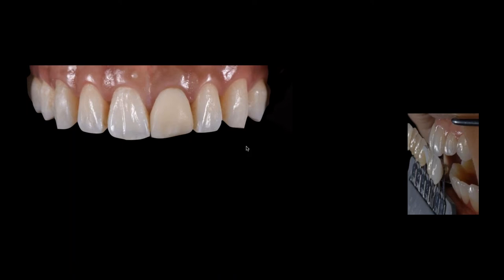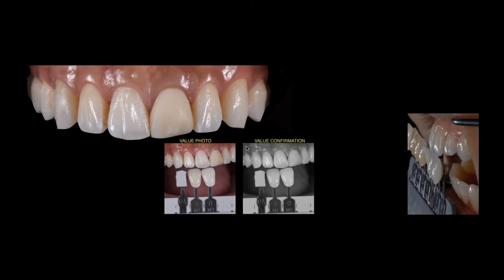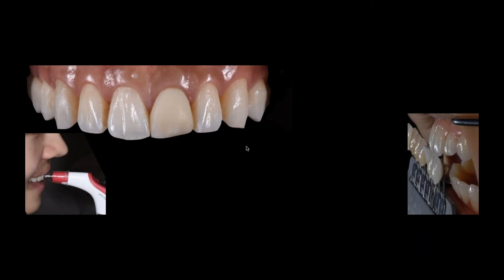So again, this is the most challenging when we're doing single teeth or very small restorations. We're going to start with our photography, obviously, and the photography is very important for us to understand the value of what we're looking for. I don't want to pretend like it gives you all the answers, because it doesn't, but it definitely gives you a better general path of the direction you're going. So for me, I always start with my value. I want to confirm that value through my black and white or my gray out photos. And then I'm also going to take a chroma photo of my shade series. That's really critical for me with every case I do. And I don't care if it's a single central or a full mouth rehab. I need some basic information about where the teeth belong in the face. When I do get into smaller restorations like single centrals or two unit cases or congenitally missing laterals, I can't survive anymore without polarized.